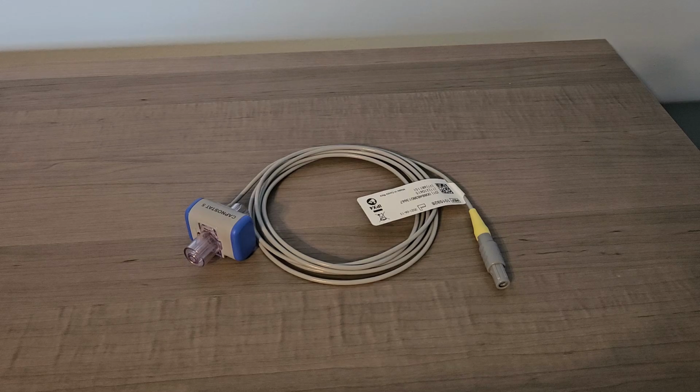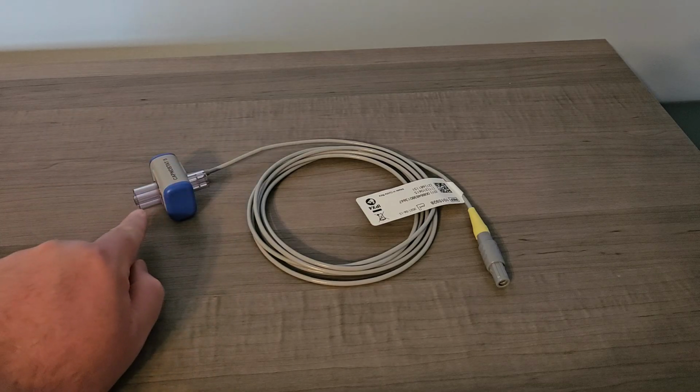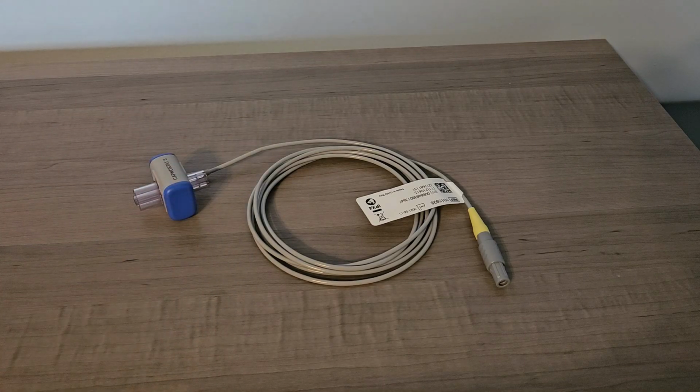Before attaching the sensor onto the endotracheal tube, the sensor should be zeroed. This will calibrate your sensor and adapter to the room air. For best results, please wait at least 2 minutes after attaching the adapter before zeroing. With the adapter connected to the sensor, place the sensor in a stable location with no air moving through it, and both sides of the adapter open to room air.